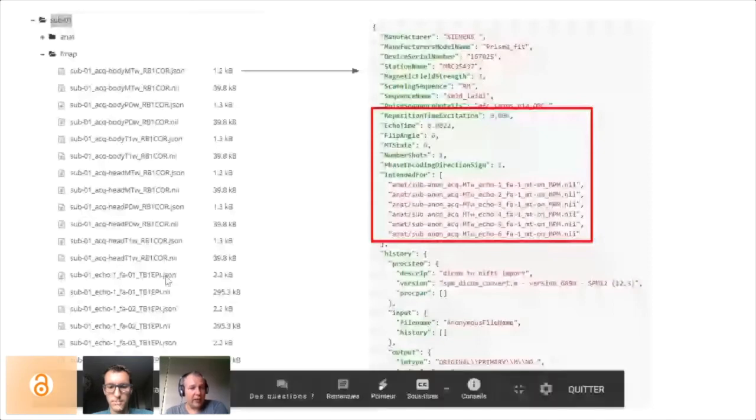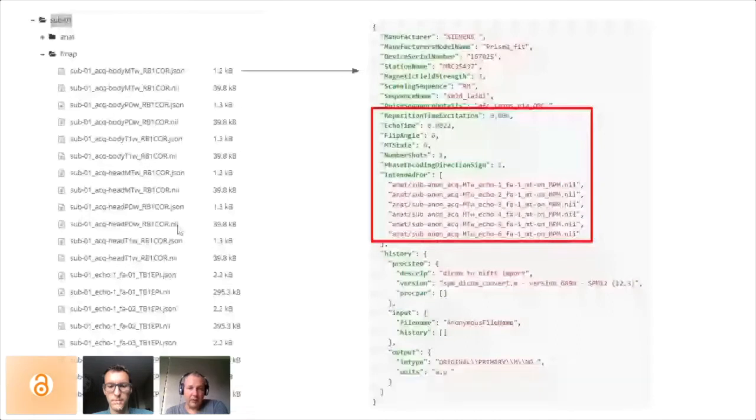Here it's using an API protocol, and effectively you're also providing the necessary acquisition parameters that are of importance to use those data, as well as pointing to which anatomical images they pertain, and they are intended for here the MT on echo 1, 2, 3, 4, 5, and 6. So that's just to say that these images will be, of course, necessary to properly correct those images.